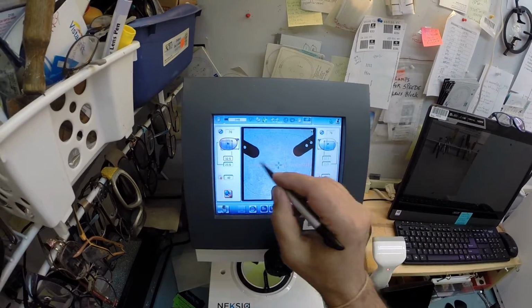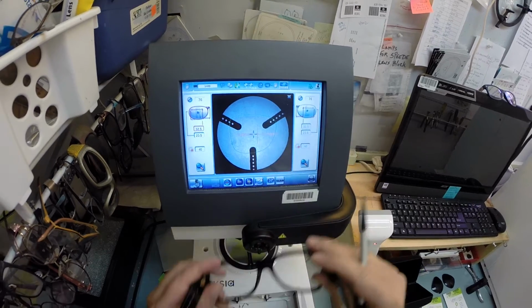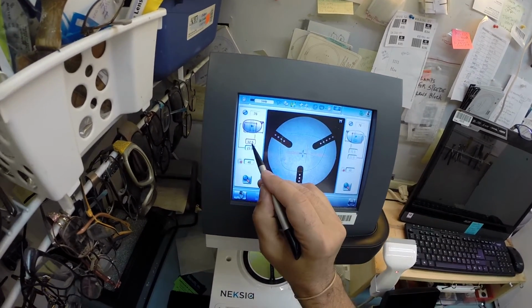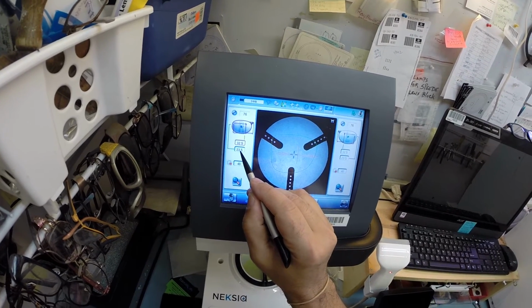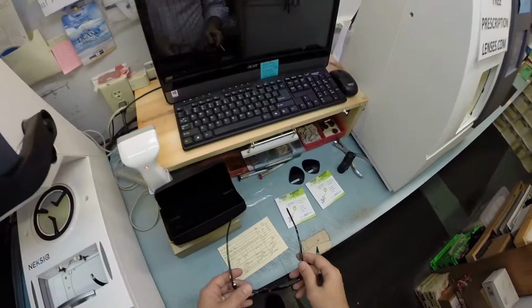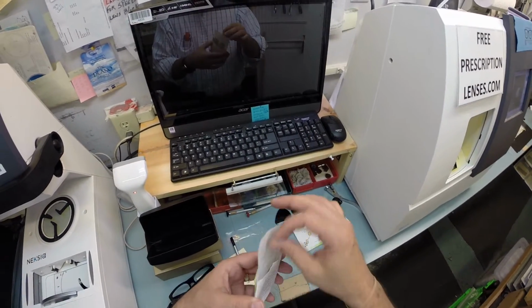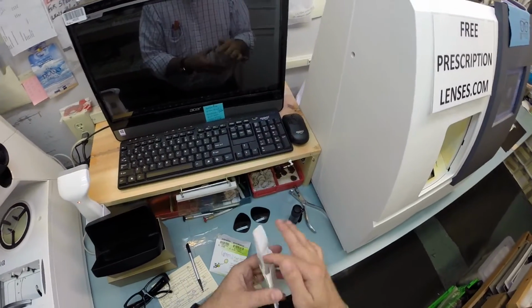So this is the size of the lens, the shape of the lens. That's the actual size, that green outline that I'll be cutting. Now, if these were prescription, I'd put in the pupillary distance here and even the optical center height, but none of that matters since these are non-prescription. I'm just going to take your lens out of its protective sleeve. I'm going to take the first one out, place it on the platform. Let's do the same thing for the second one.